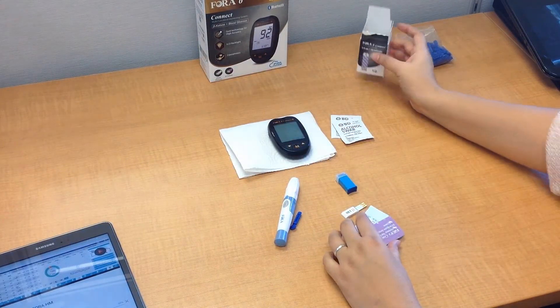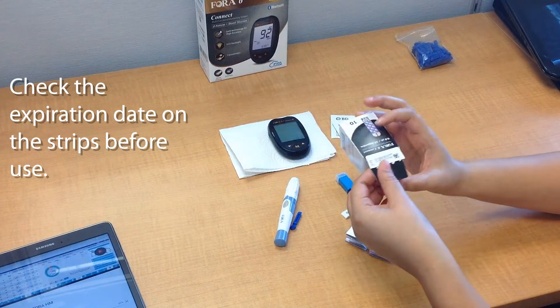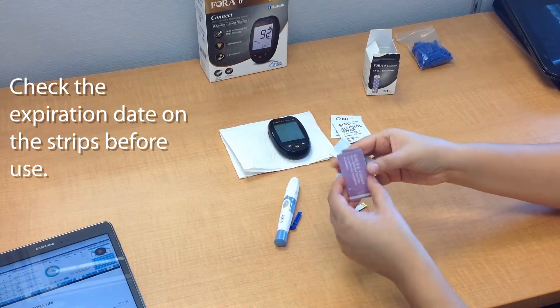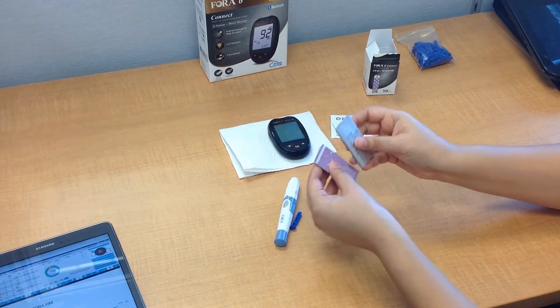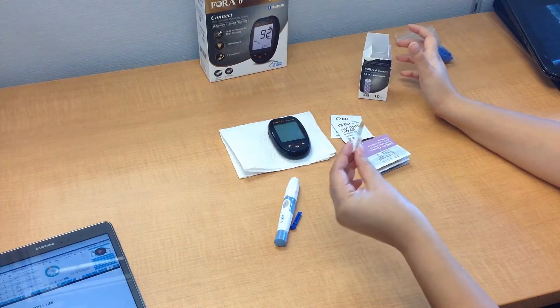It's important to note that the strips do expire, so make sure that before you start your test, you check the expiration date either on the box or on the individually wrapped test strips — you can find that on the back. Also, make sure that with the test strips, you do have the coding strip.